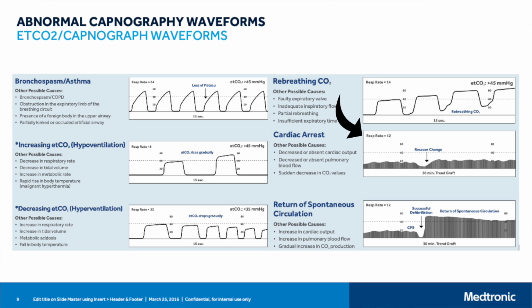Then also we need to utilize capnography during CPR. It's going to help us determine, are we giving steady compressions? Am I doing good chest recoil? Am I getting tired? These are things to consider whenever you're looking at that waveform.